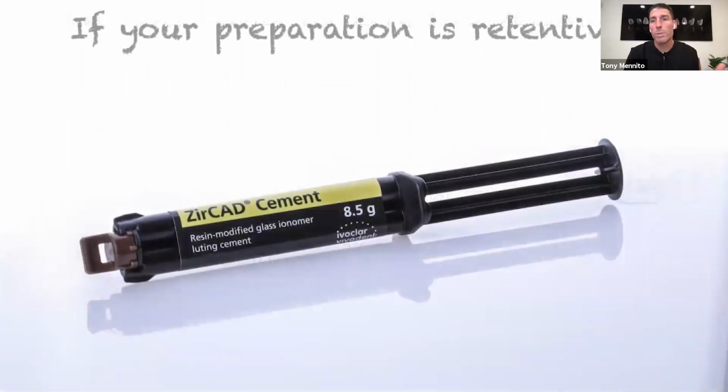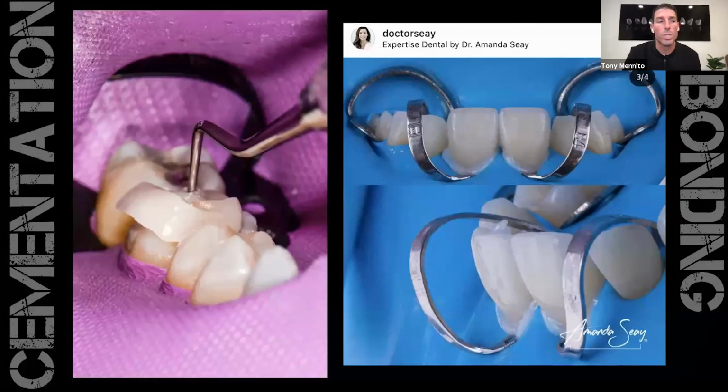And then, of course, if your preparation is totally retentive, like we talked about before, you can just use a resin-modified glass ionomer like ZirCAD cement for that. So you have a lot of different options because of the strength of zirconia. You just got to know what that strength is and know what type of zirconia you are using.